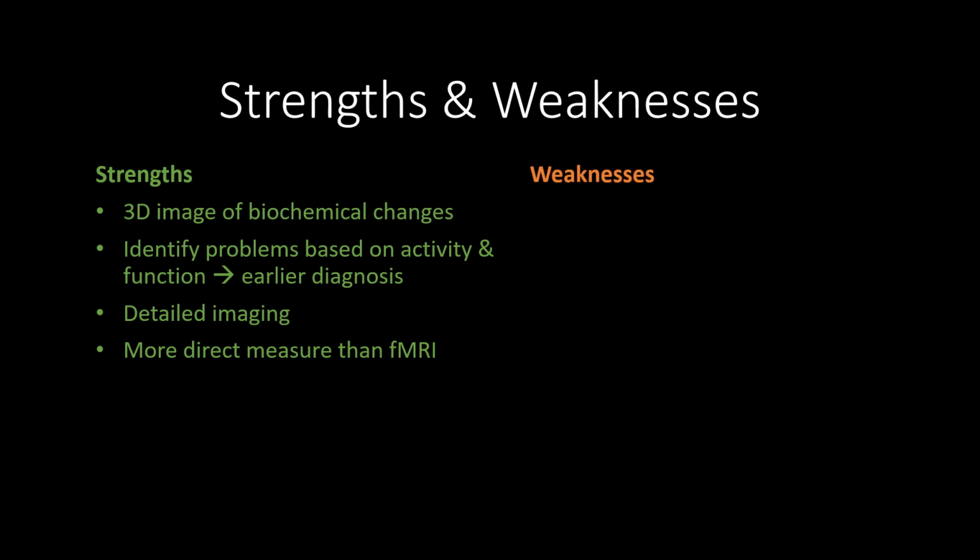The risks associated with a PET scan are very small and are due to reactions to the radioactive tracer injected. However, the chances of a negative reaction occurring are incredibly low, as the level of tracer given to a patient is very tiny. The radioactive substance also has a very short decay, which is good news regarding risk of radioactivity, but can lead to issues as appointments must run on a tight schedule.